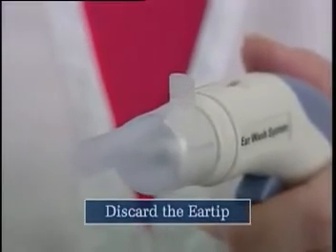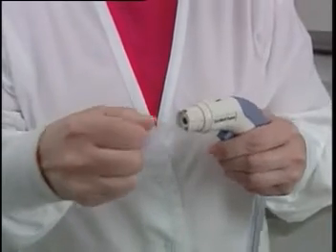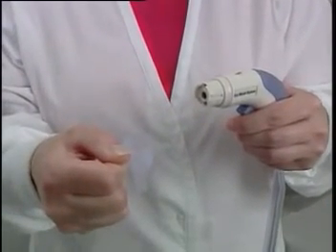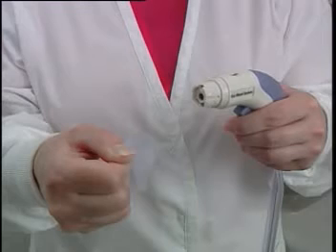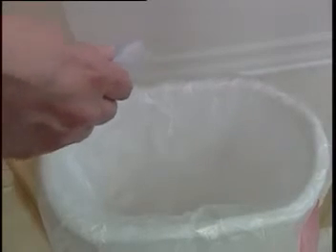When the irrigation is complete, grasp the tab located on the ear tip and pull the ear tip off the handle with a downward motion. This allows you to easily remove the ear tip from the handle and dispose of it. Remember that each ear tip is designed for single use only and must be discarded properly after use.